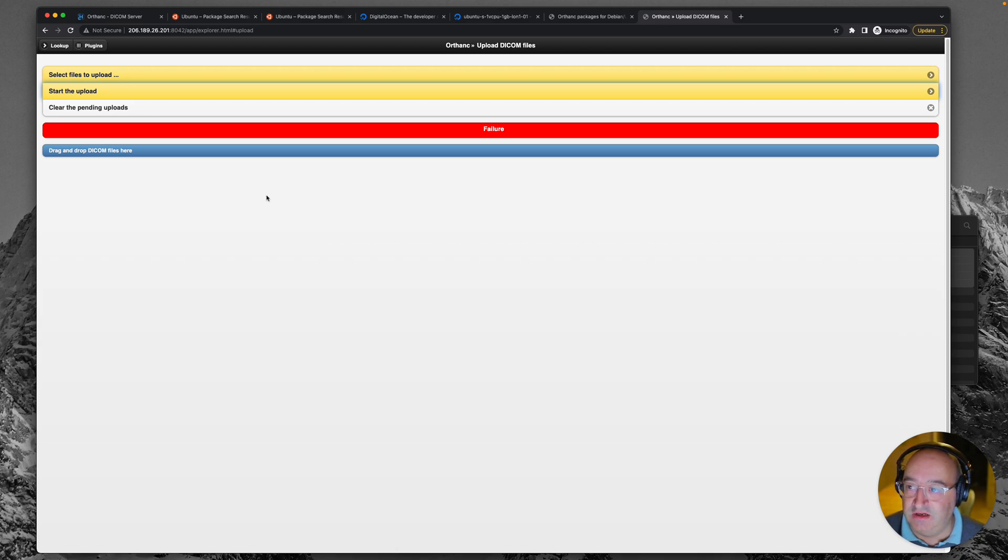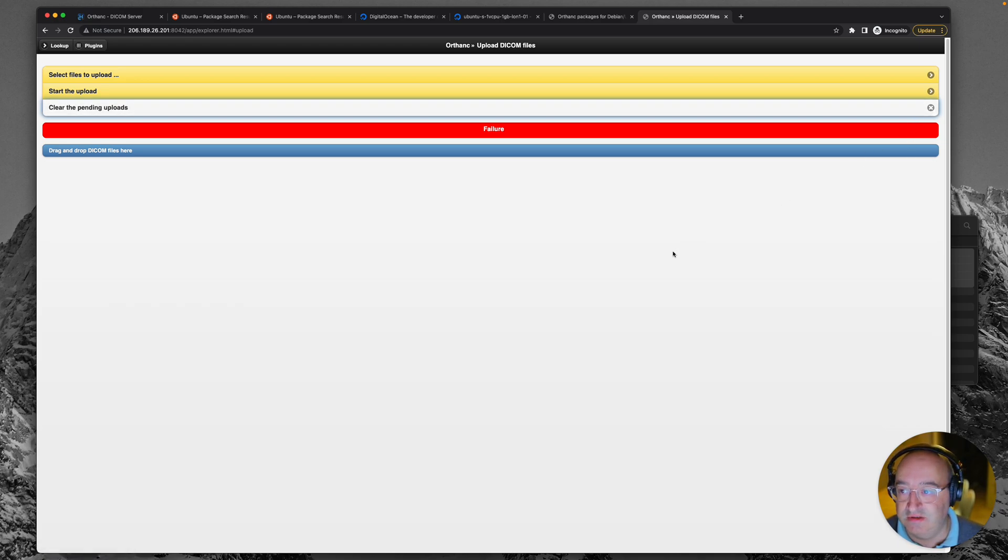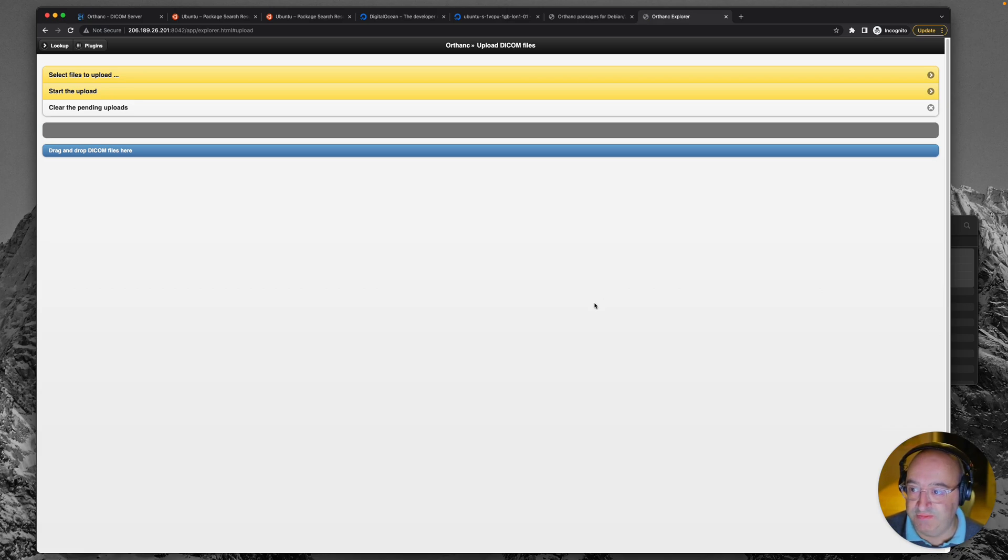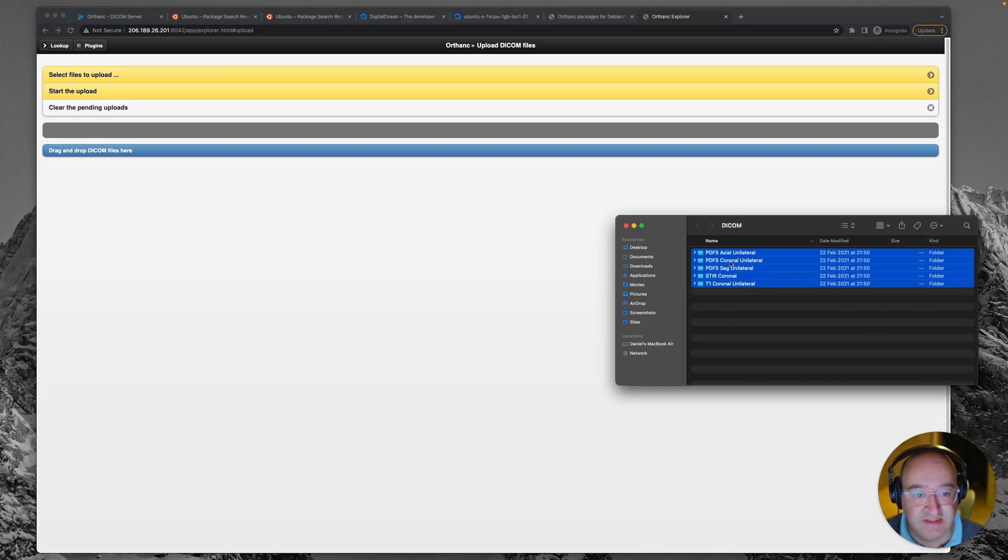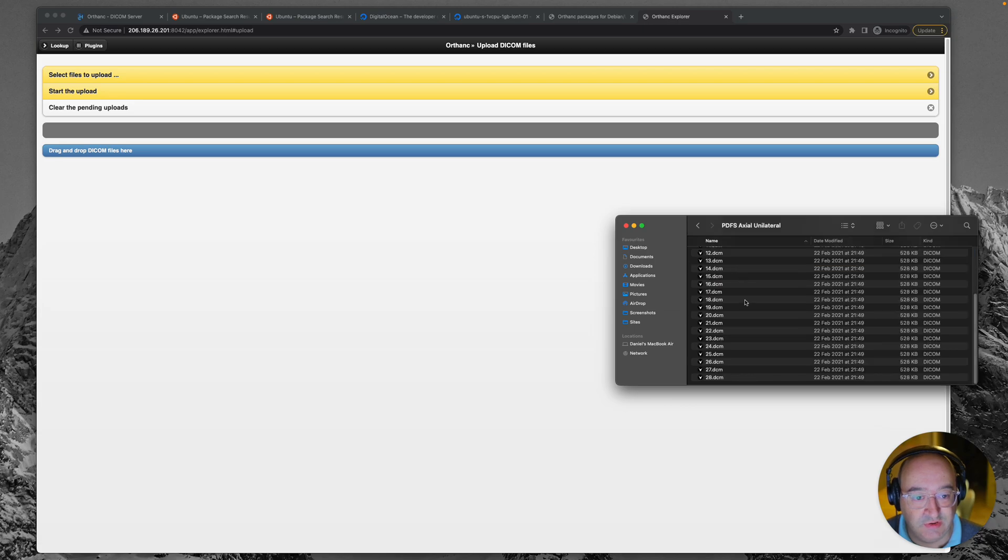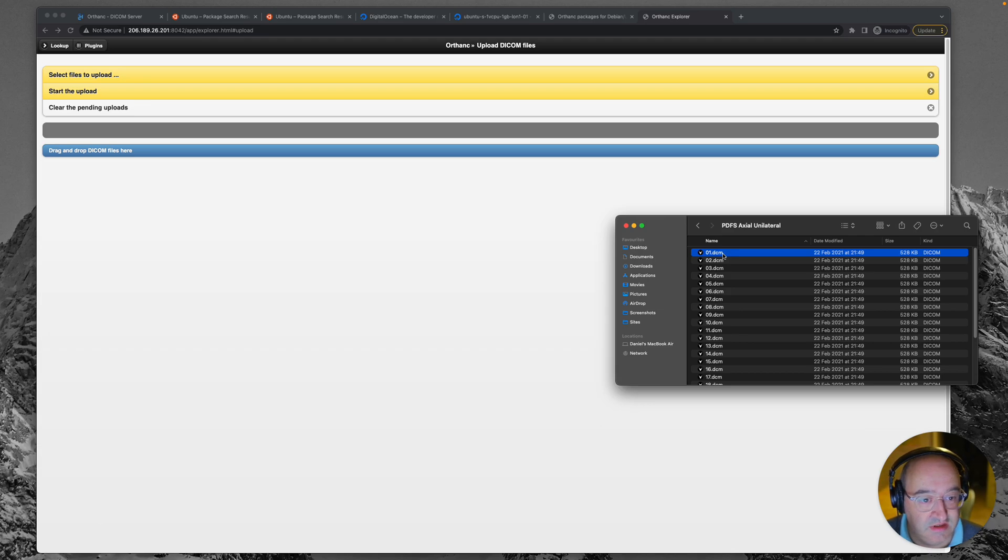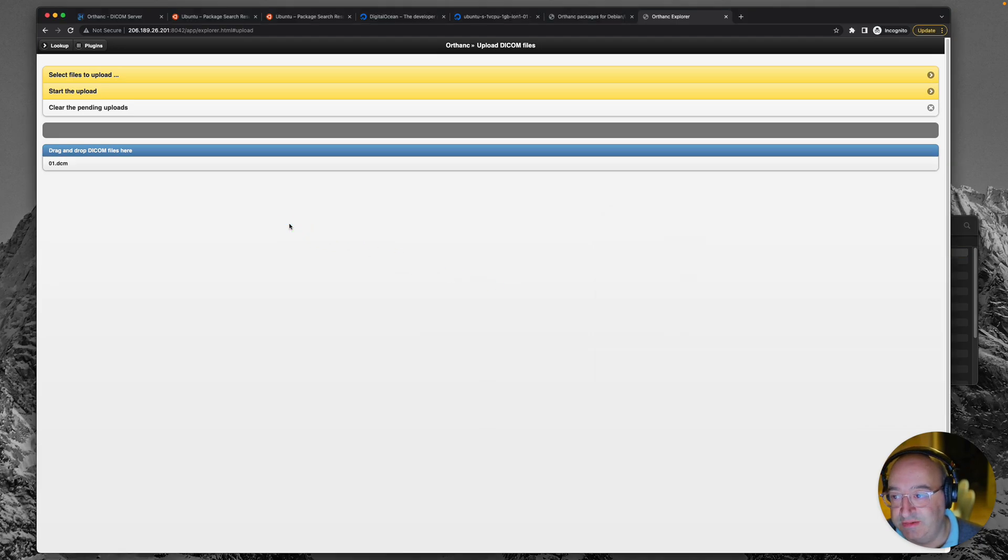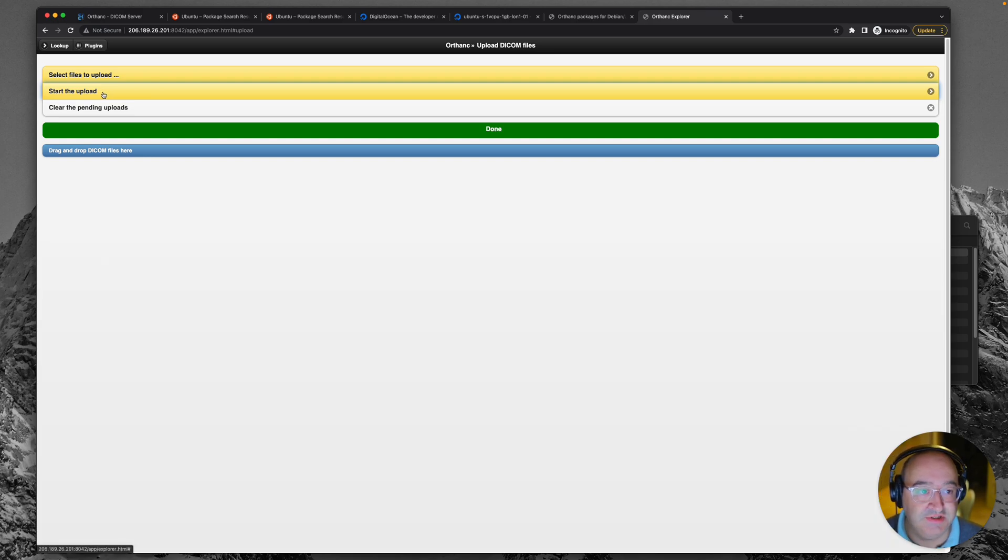Oh, I wonder why that's happened. Maybe we should try something a bit simpler, like I'm just going to hit clear pending uploads, refresh my page and I can go again. So maybe we just need to try something a bit simpler, like a single image. So I'm going to go into one of these folders and we'll see the individual DICOM files. So I'll just go with this one, the single image and try to start upload again. Oh, green done. It's worked.